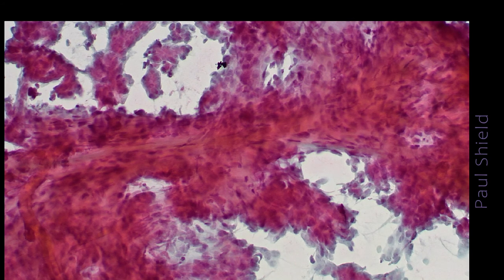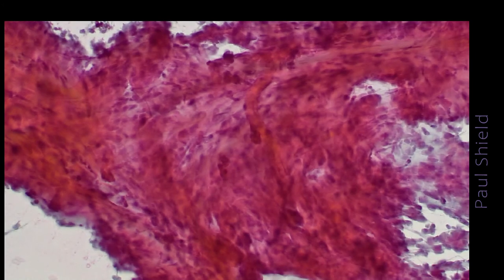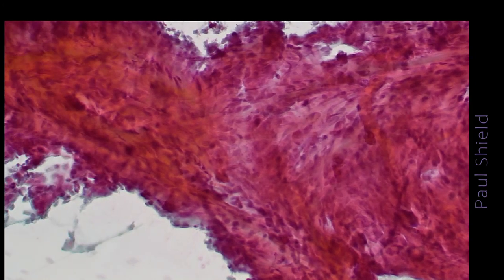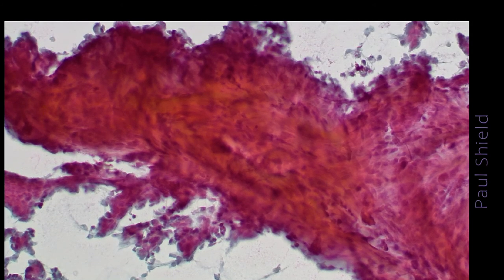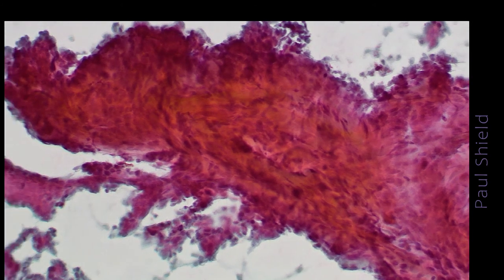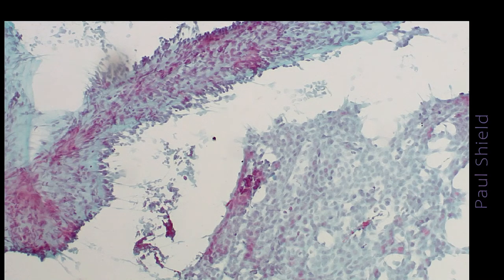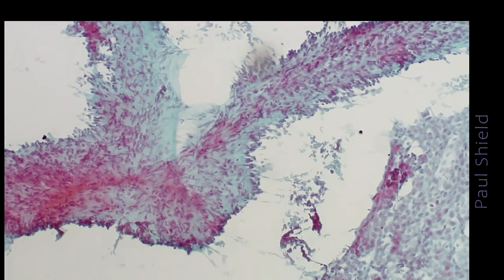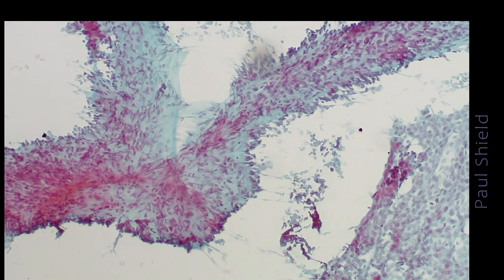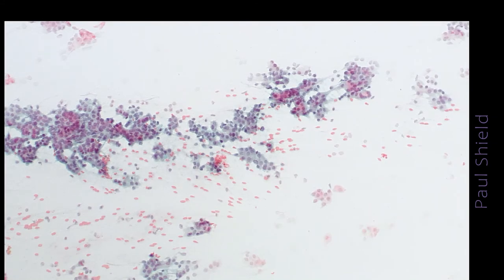And then in the background we have epithelial cells, and you'll often see them palisading in like a crowded palisade around the outside of the group. Often you can make out a bimodal pattern in those, but not always. Sometimes you'll get like this, which is like stripped cores, this collagenous vascular material that the epithelium has been stripped off, and you can see it lying in the background.